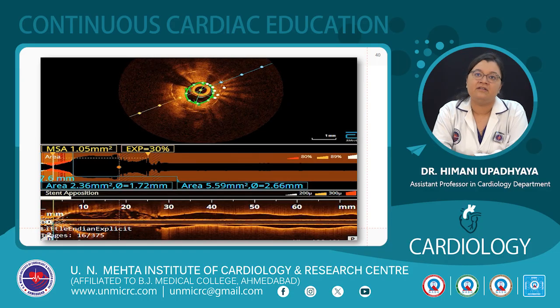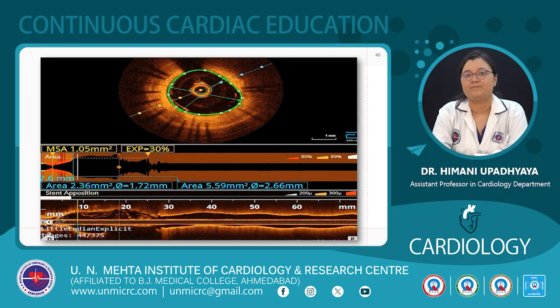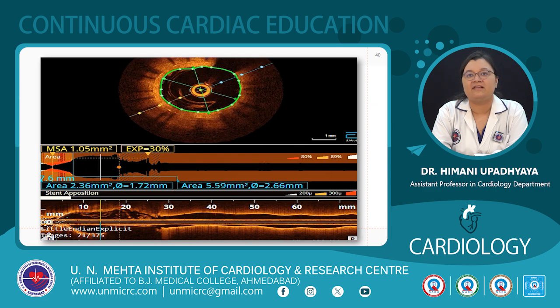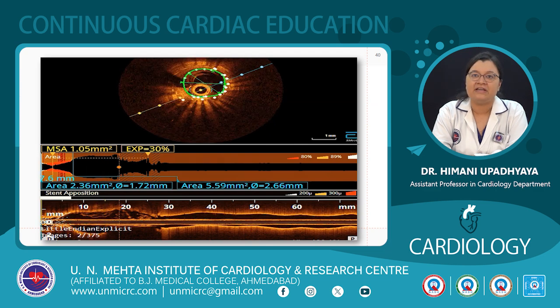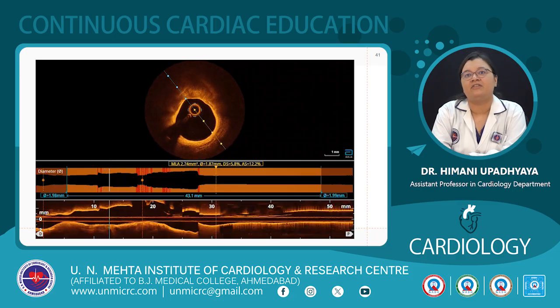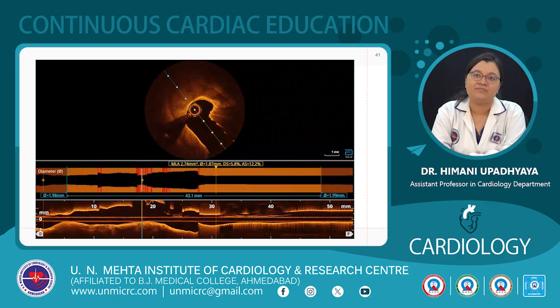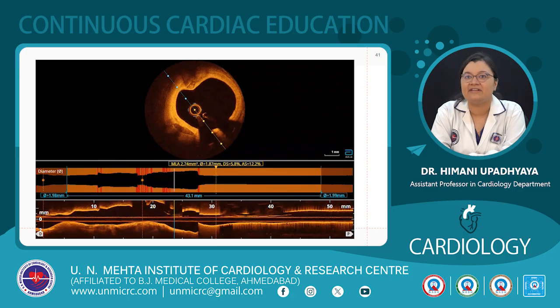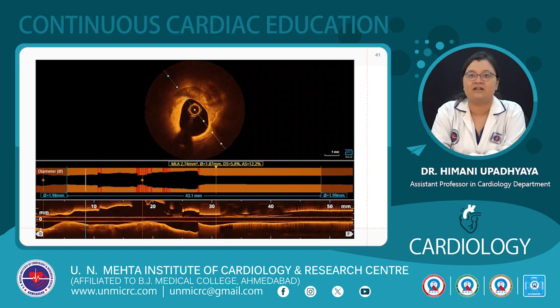In this second run, post-DES implantation, the patient came with ACS and STEMI, and on the OCT run, we can see homogeneous NIH formation in the stent with an MSA of 1 mm square. In the third run, we can see a fibrocalcific lesion with heavy calcium that is clearly defined with a minimal lumen area of 2.7 mm square. That is the culprit lesion.